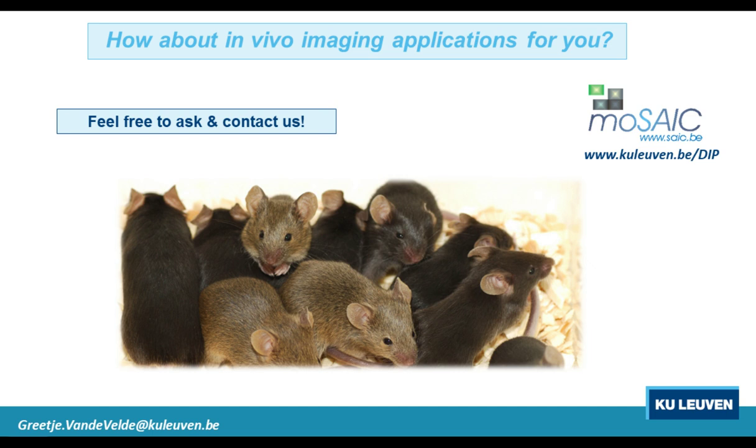And that is also something that in our approach we try to keep simple and doable, to find something that is robust and that any biomedical scientist, anybody working with animals, can do by themselves. And then we just use the software provided by the manufacturer that is delivered together with the scanner. And that really gives us all the software we need for visualization, but also for processing. And it even allows us to build custom processing algorithms for dummies, if I can say it that way, that even if you're not a programmer, you can really build something that works for your mice.